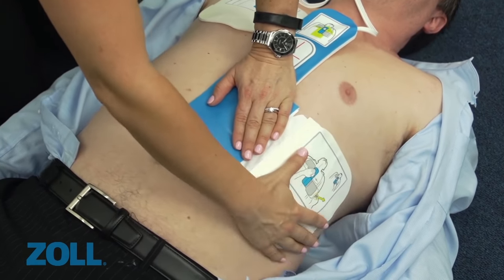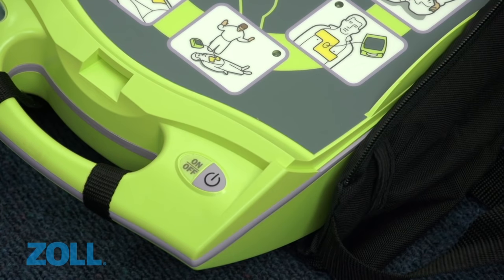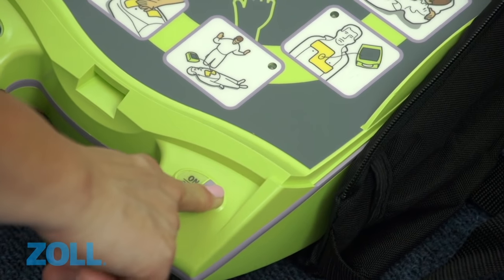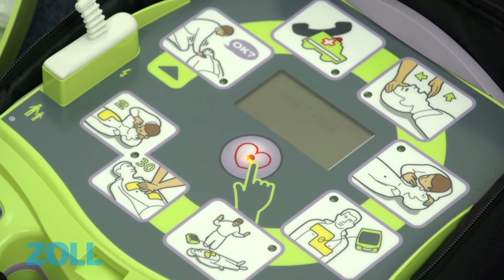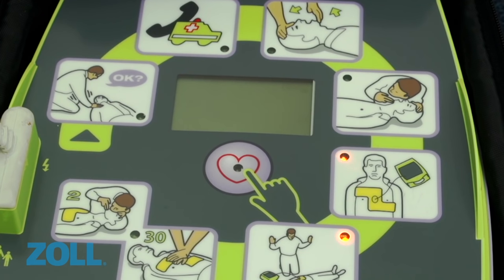In this instance, you can attach the electrode pads to the chest prior to switching on the AED Plus. Adult pads. After powering on, the AED will jump straight to the analysis stage in order to save time. This enables you to deliver therapy and CPR treatment faster.